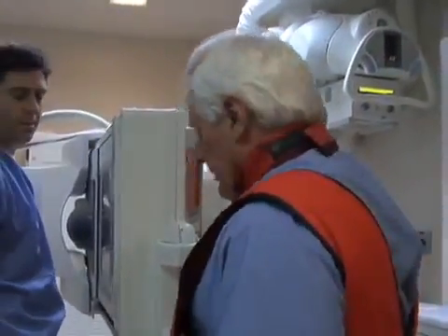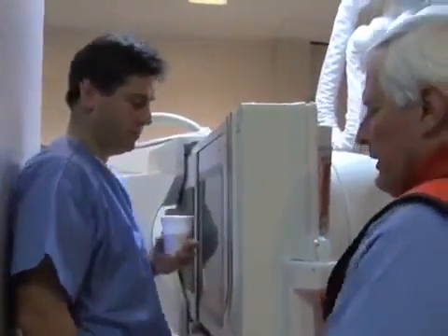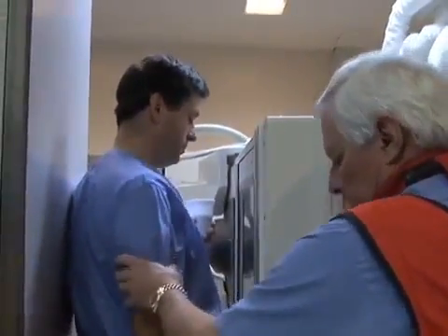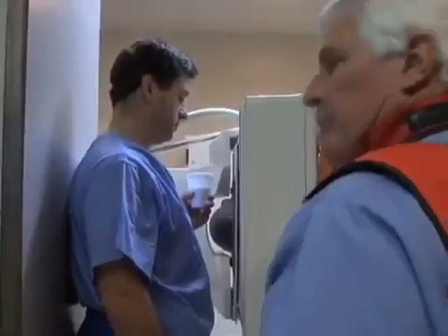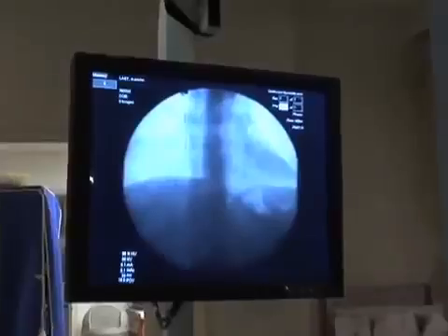Okay, we like to do this in the upright position. I'm going to hand you this cup of barium — hold it in your left hand, turn slightly to the left, and leave your right arm down at your side. I'm going to fluoro now, and I want you to go ahead and take two big swallows for me, and we'll look at the distal esophagus.